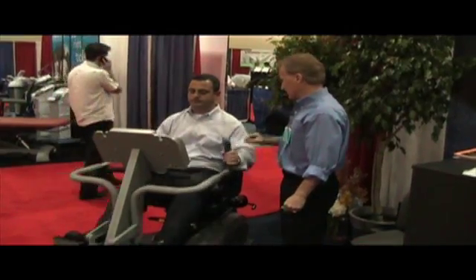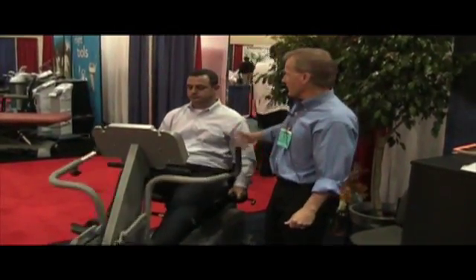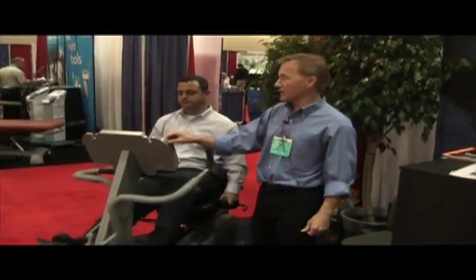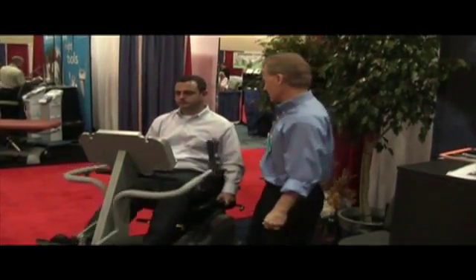The patient can also drop their arms down to the hand grips and record a heart rate, or if they prefer, they can wear the Polar chest strap and receive the heart rate right on the display. There are 30 effort levels and six different training protocols.